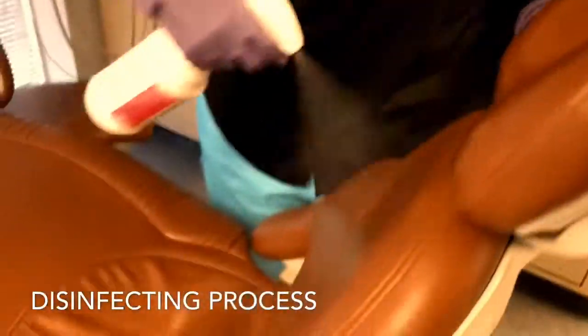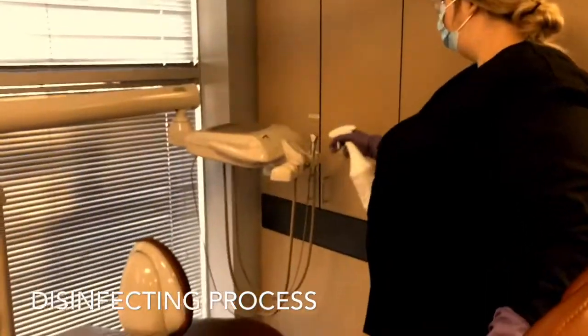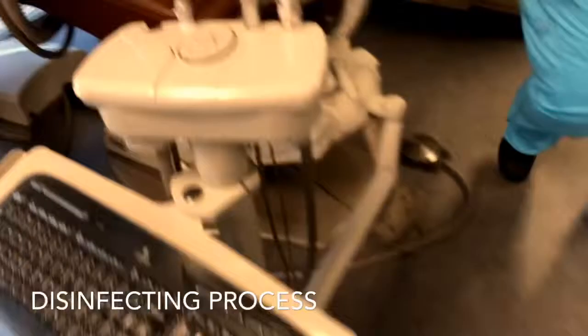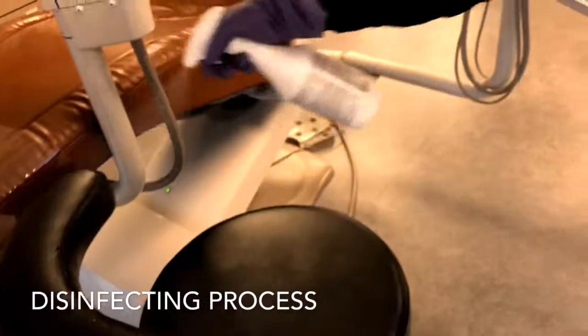And here we have Samantha spraying everything down with the Cavicide. She's going to go ahead and let that sit while Ali worries about the instruments getting sterilized in the back. As you can see, she's getting every part of the operatory room. Always make sure to never leave anything out because everything needs to get disinfected.